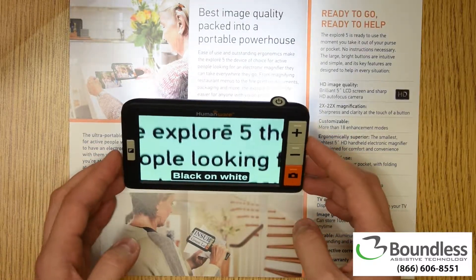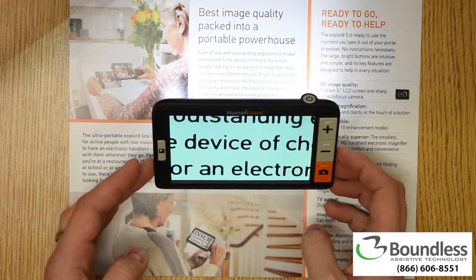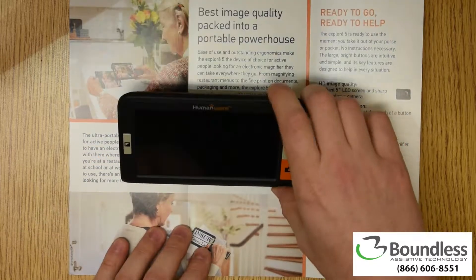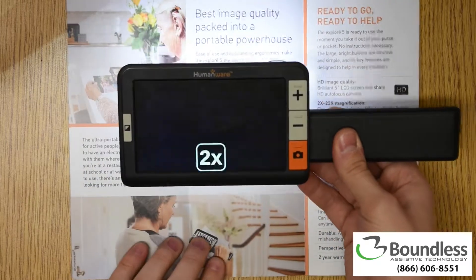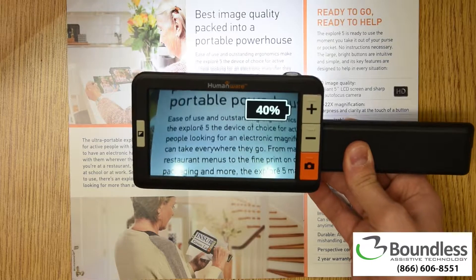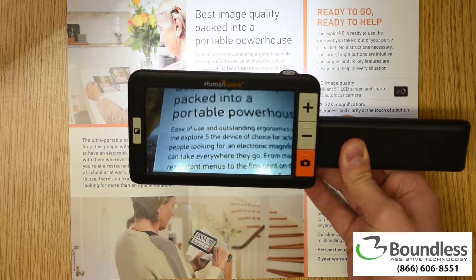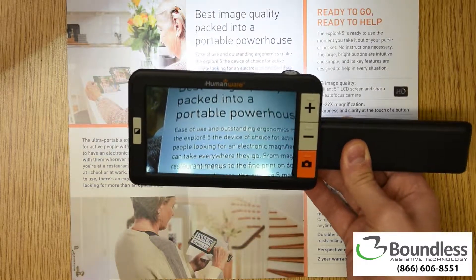So a very helpful tool with that big 5-inch screen. Folks really like how sleek and simple this product is to use, and having that varied use with the handle. Turning it on and off instantly is another big help as well. If you'd like to discuss this device with us, we'd love to talk with you. Our number is 866-606-8551. Thank you so much.